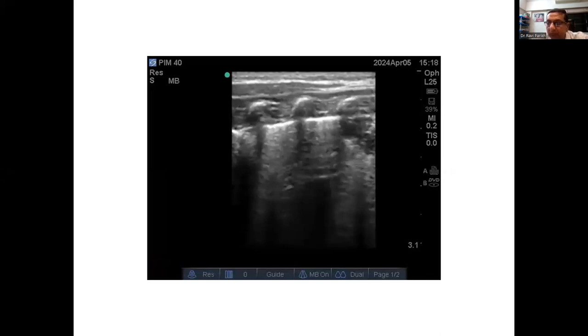You can get shred sign after pulmonary hemorrhage, but this is very patchy, and usually shred sign after pulmonary hemorrhage is quite, I would say, low bar. This for me would be very consistent with infection, demonstrating a significant patchiness to it. You've got static air bronchograms as well. And again, post-pulmonary hemorrhage, you don't usually see a lot of static air bronchograms. You see lung destruction giving a shred sign. So the static air bronchograms would go more in favor of a pneumonic kind of consolidation.